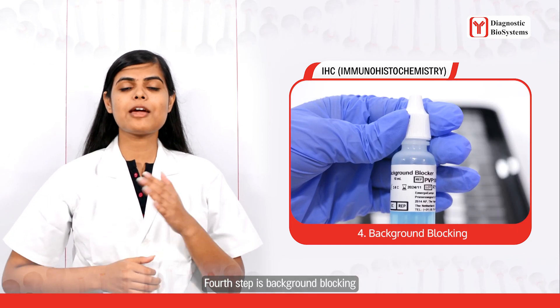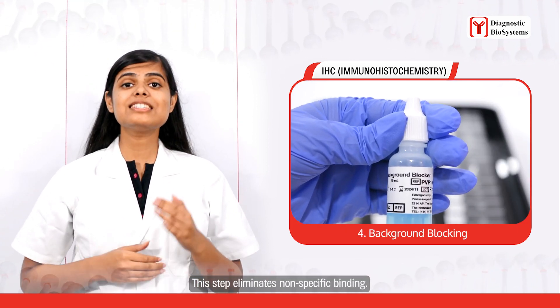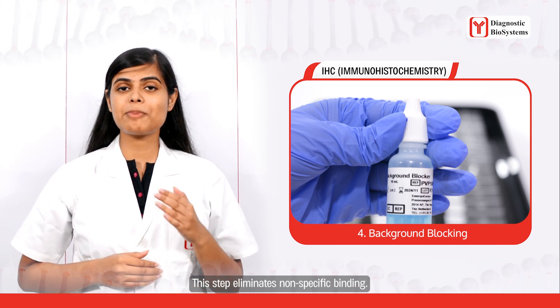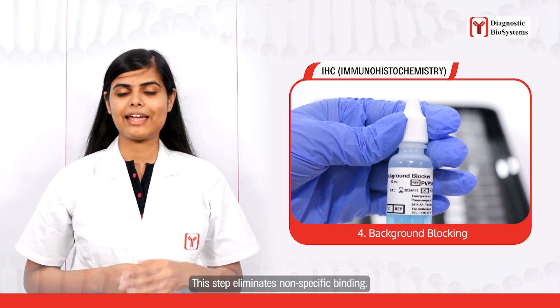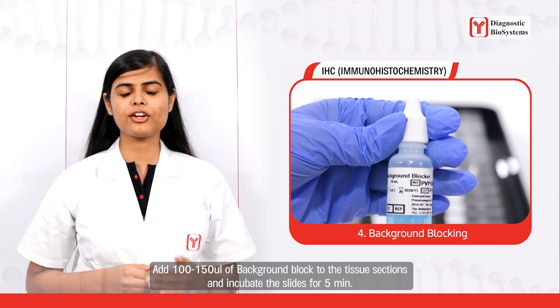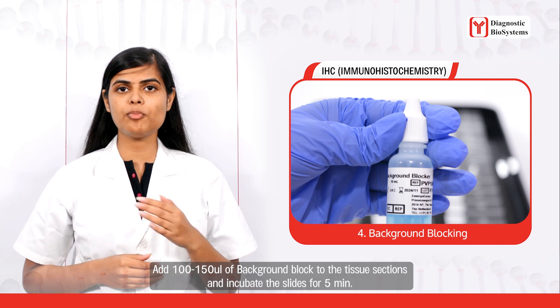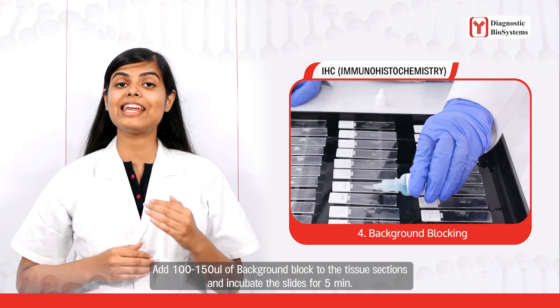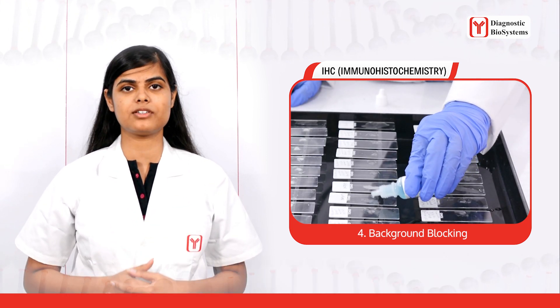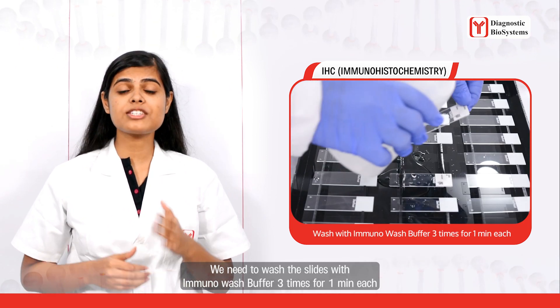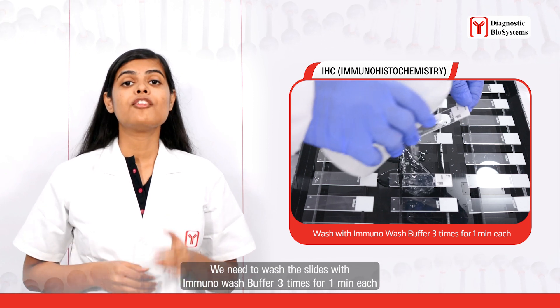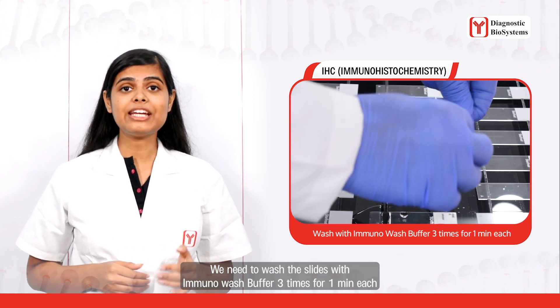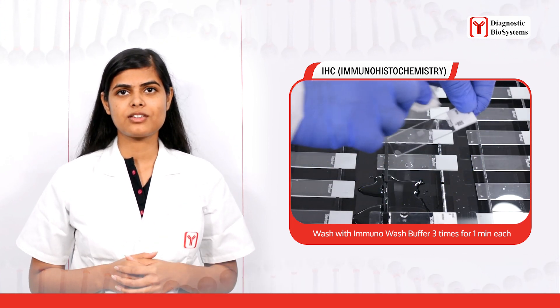The fourth step is background blocking. This step eliminates non-specific binding. Add 100 to 150 microliters of background blocker to the tissue sections and incubate the slides for five minutes, then wash the slides with immunowash buffer three times, one minute each.